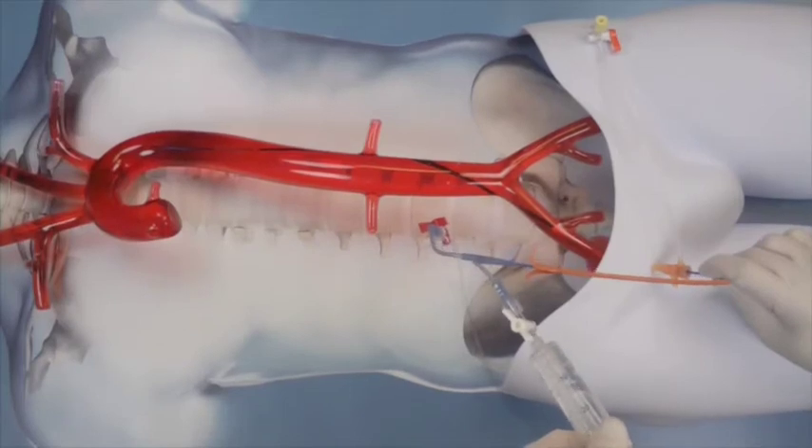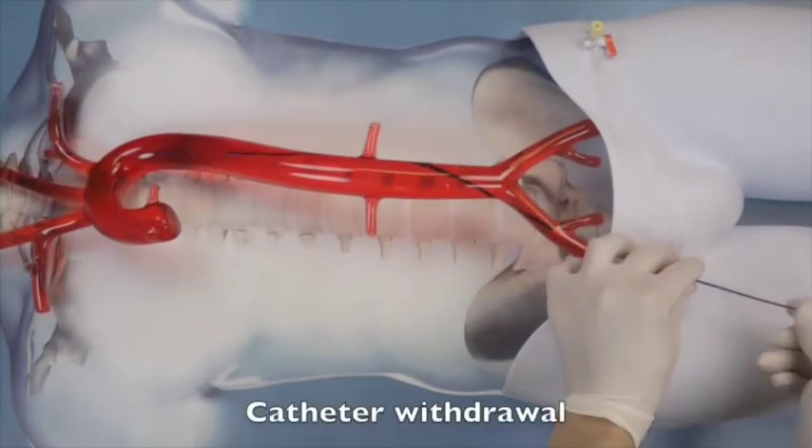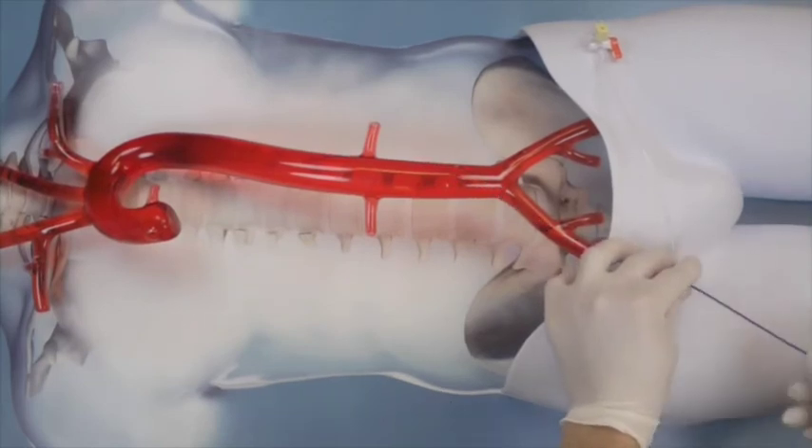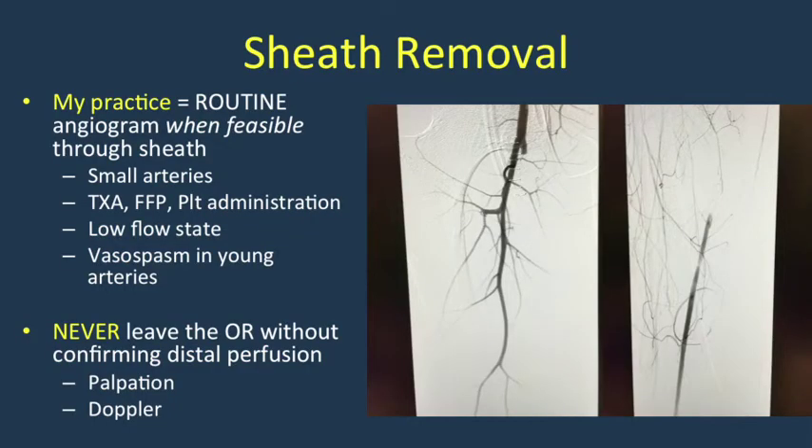Once the case is completed and surgical control of hemorrhage is achieved, balloon removal is quite simple — it is maximally deflated and extracted through the 7 French sheath. Comparatively, sheath removal can be a more concerning process.